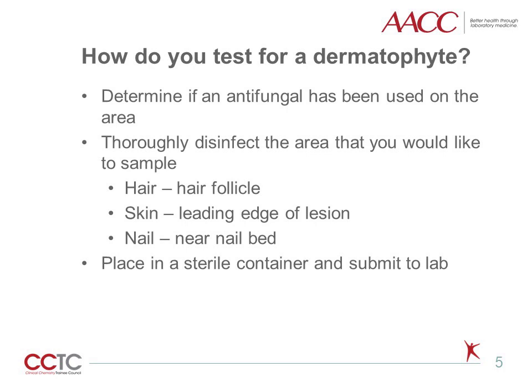Scrape skin with a scalpel or glass slide at the leading edge or the area that looks most recently affected. The centers will likely only contain non-viable organisms and are not useful for culture. For nails, clip or scrape the underside of the nail, getting as near as possible to the nail bed. All collected material should be placed in a sterile envelope or container.